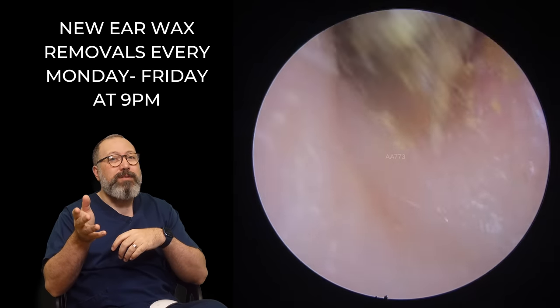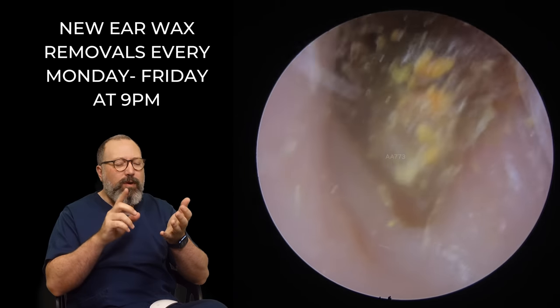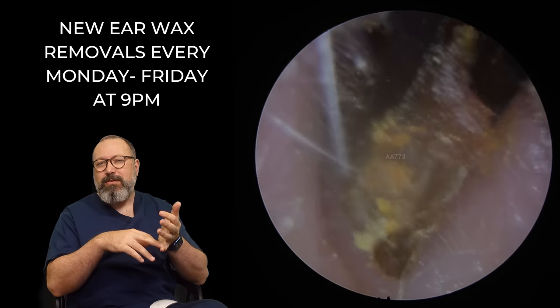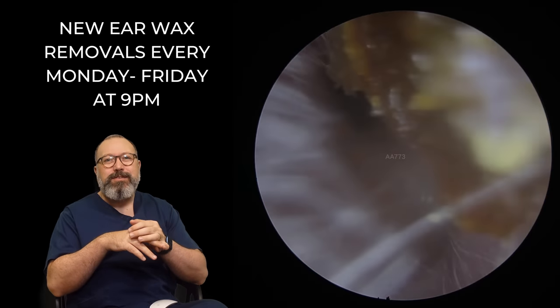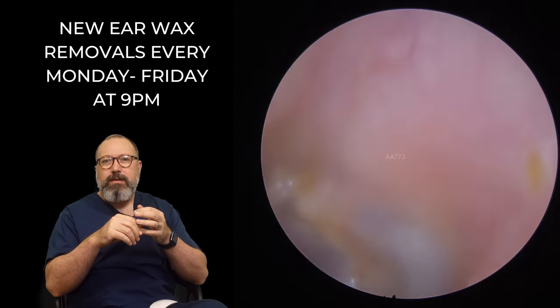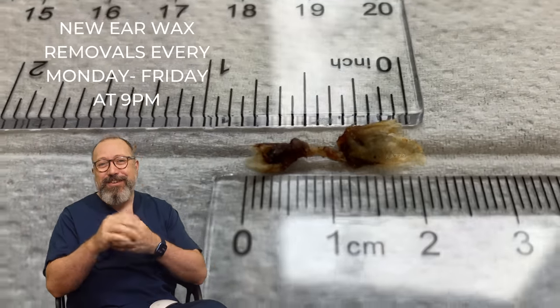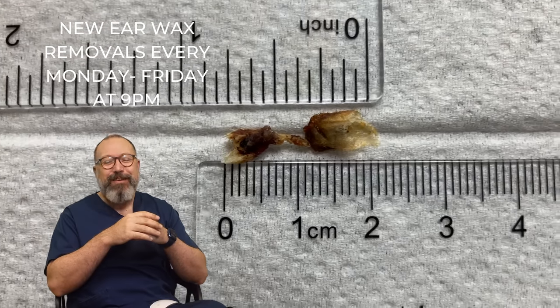There were a couple of people who mentioned in the comments about the mastoid cavity clearance. One person asked me what was the youngest person I'd ever removed wax from — I think they were just under three years old. We don't make a habit of it because ear canals are very, very tiny and toddlers don't tend to like to sit still for very long, so we tend to see older children really. Let's see the ear canal looking nice and clear — so that was all the first patient. Two centimetres, three quarters of an inch worth of wax and skin coming away.